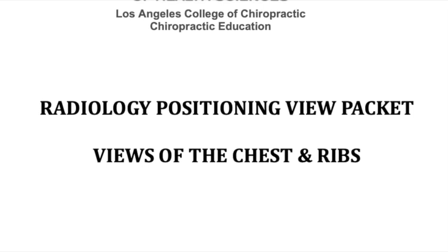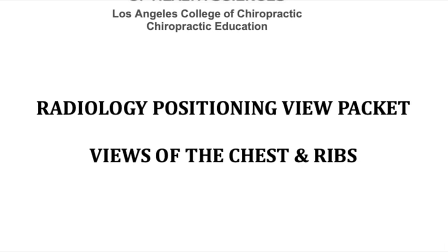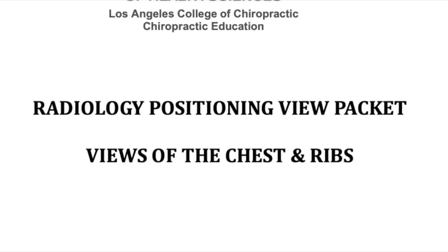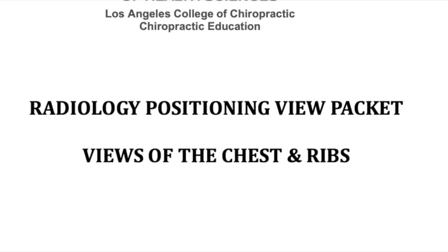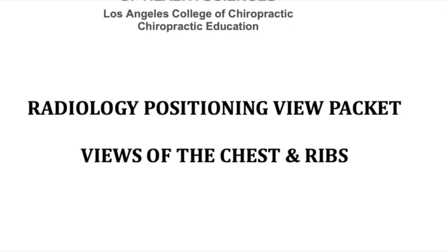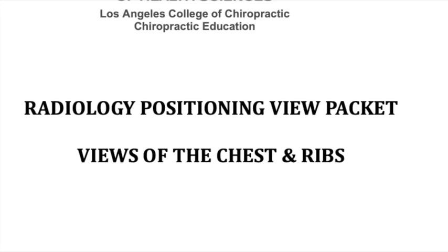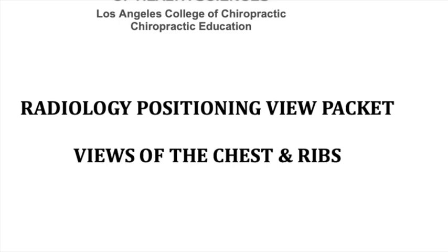For patient positioning, we ask the patient to stand 1 foot away from the bucky, facing the tube, and lean their shoulders and head back to rest on the bucky. Their hands should be placed on their posterior superior iliac spines, with their shoulders rolled forward to abduct the scapulae away from the midline. If the patient cannot lean back, they should stand in an upright posture, and the central ray is angled 25 degrees cephalad after moving the tube to a 40-inch SID/FFD.